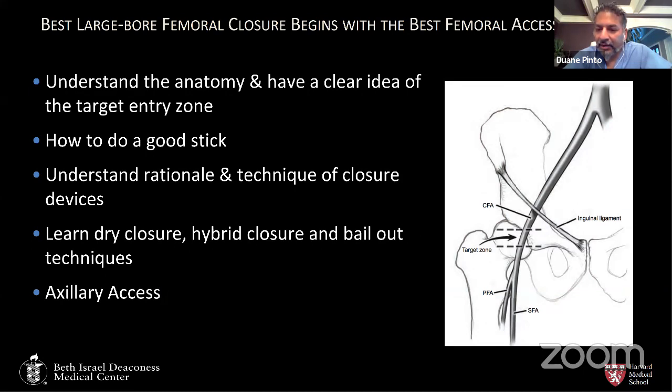If you look farther down, you see the bifurcation and you see what is anatomically the common femoral artery, but that's not in a compressible area. So with ultrasound, if you are looking for just when you see the profunda and the SFA, and when that becomes the common femoral, and you stick right above that, you can be in a non-compressible area. So the important thing is to first palpate, then under fluoroscopy, use some sort of marker and find the femoral head acetabulum area. And that's the area that you're going to look for with ultrasound and micropuncture.